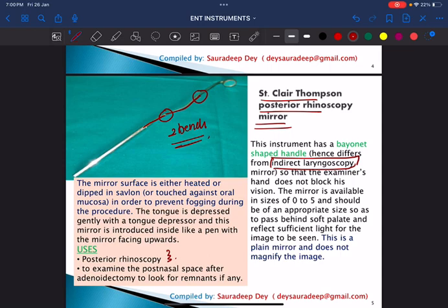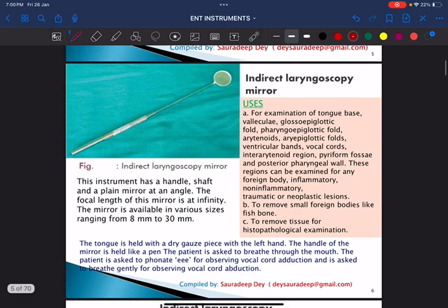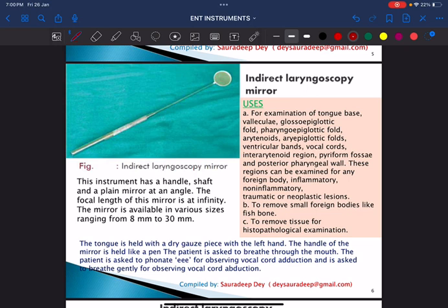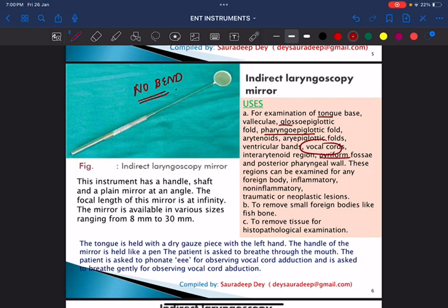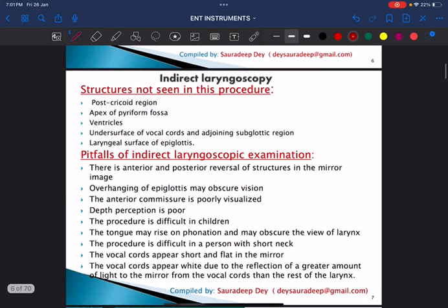The indirect laryngoscopy mirror has no bend. Structures visible during indirect laryngoscopy include the base of tongue, vallecula, glossoepiglottic and pharyngoepiglottic folds, the vocal cords, pyriform fossa, and the posterior pharyngeal wall. Structures not seen in indirect laryngoscopy include the apex of the pyriform fossa, undersurface of the vocal cord, post-cricoid region, and the laryngeal surface of the epiglottis.